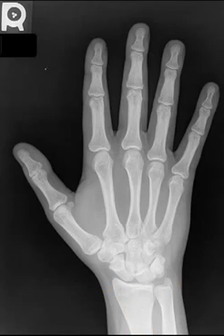Next, the joint made between the radius and ulna that you see in the wrist is the distal radial ulnar joint. It's important to say distal because there is a proximal radial ulnar joint. Here is the radiocarpal articulation between the distal radius and the carpal bones. They call this shared radiocarpal joint space.